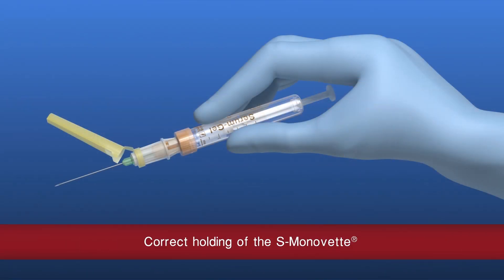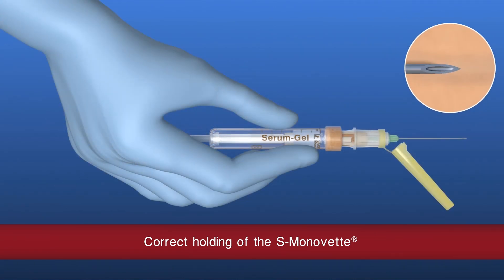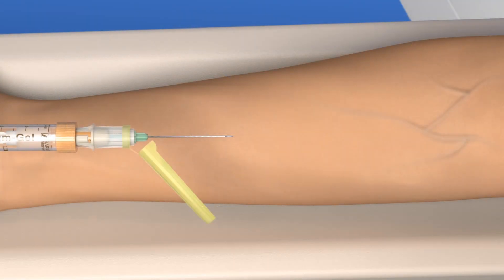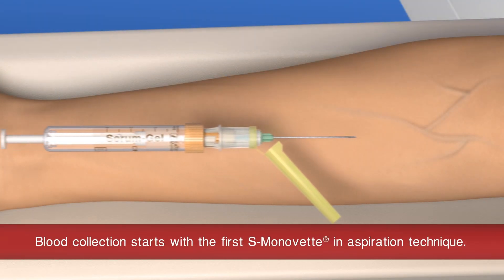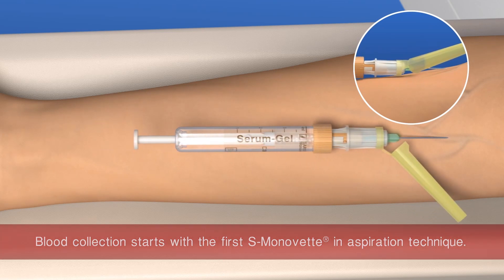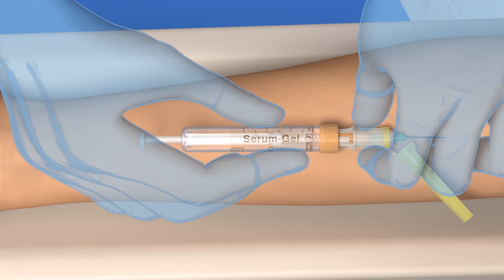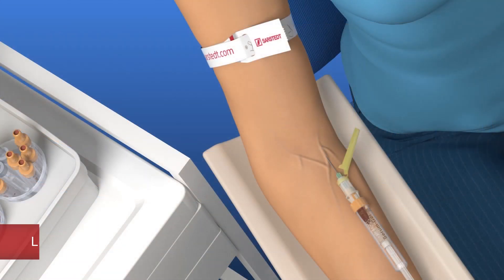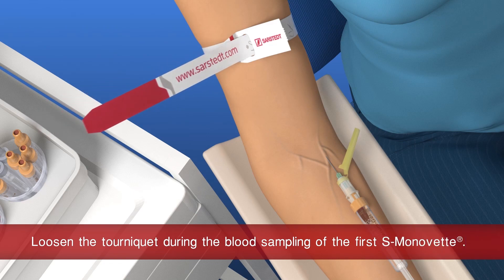After removing the protective cover, hold the safety needle with the needle bevel facing upwards. The needle protector should always be on the right-hand side. Stretch the skin and hold the vein in place. To avoid piercing through the vein, puncture it at a flat angle. Upon successful puncture, blood will begin to flow into the S. Monovet. Then gently pull back the plunger.